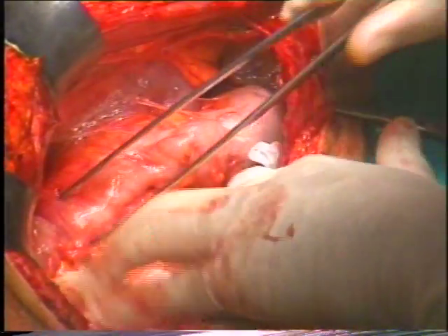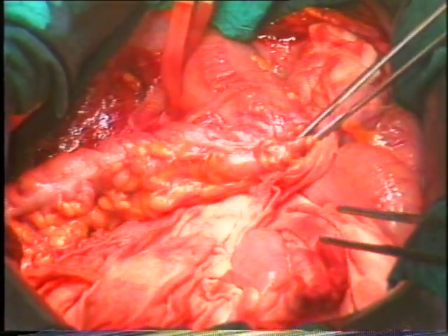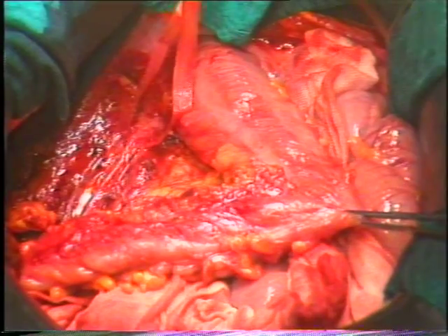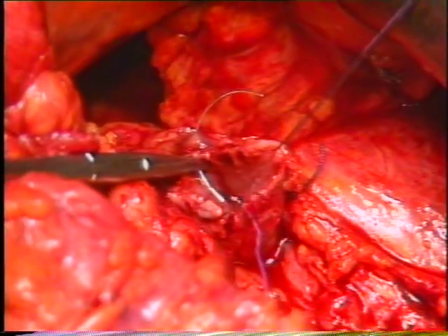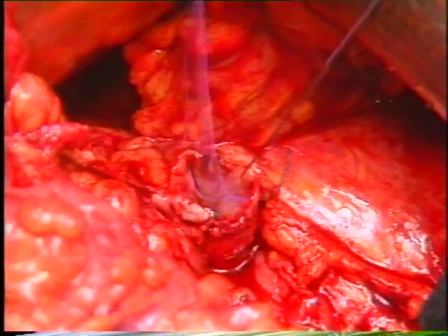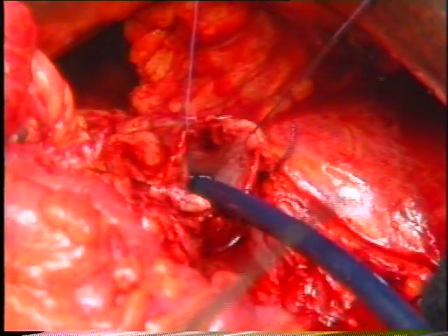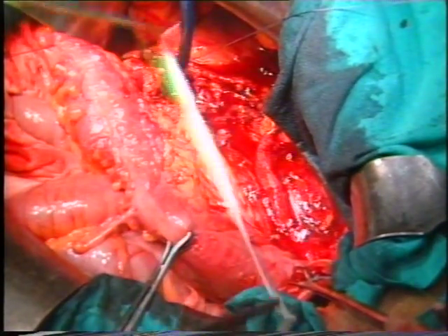The pathologic ureter is exposed by incision of the paracolic gutter and reflection of the descending colon. The whole ureter from the pelvi-ureteral junction was excised in view of extensive bilharzial pathology. The dilated pelvis is marked by stay sutures. The length from the renal pelvis down to the urinary bladder is measured by a tape.